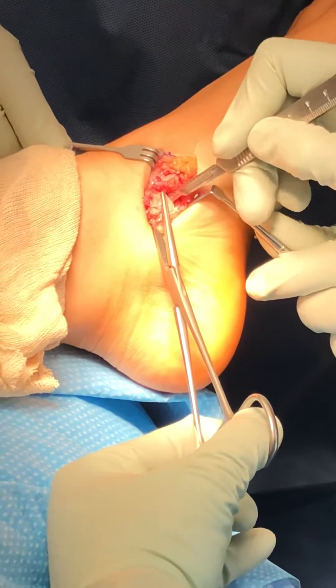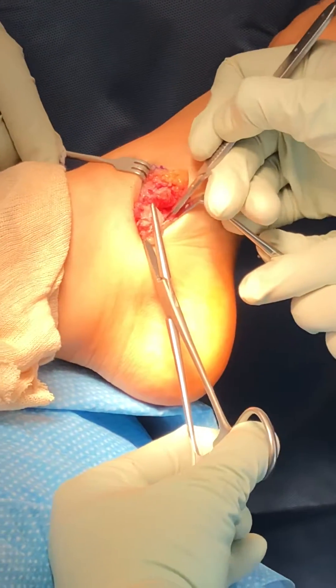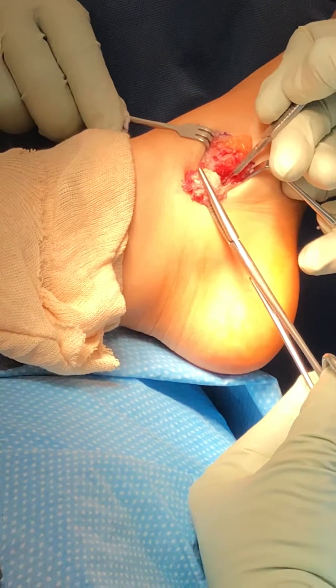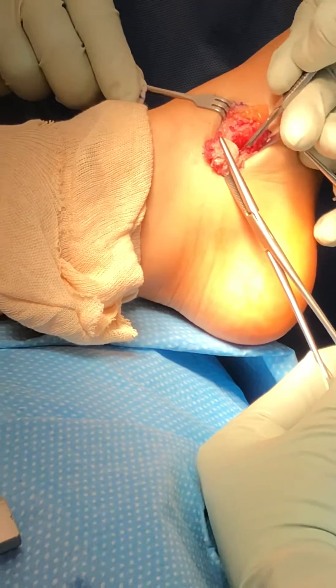Removing more of the soft tissue from the extra ossicle, circumscribing around the ossicle, freeing it from the tendon, leaving the tendon intact but separated from the bone.